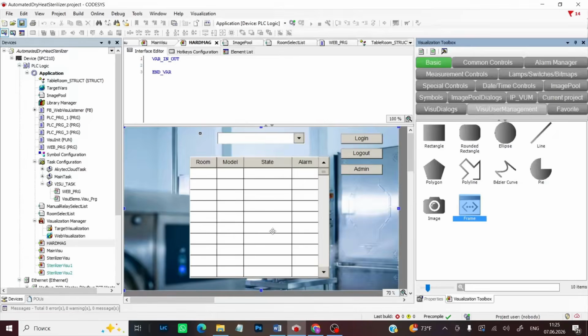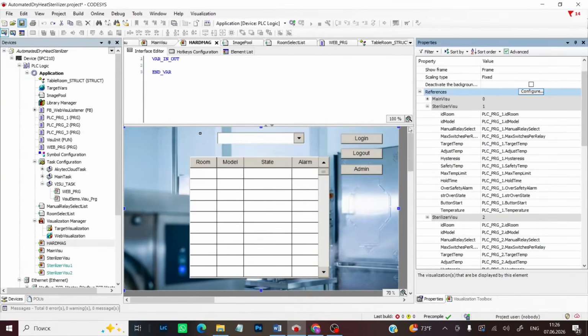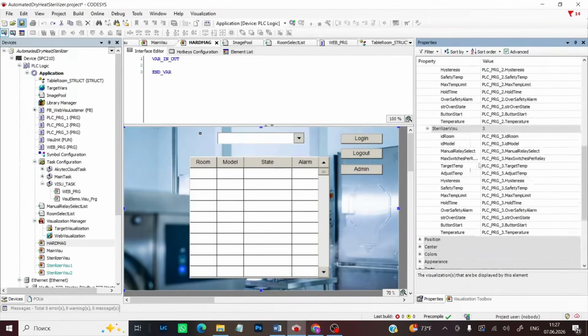Next, I created another visualization file, where I placed a frame component and added 1 instance of the main visualization and 3 instances of the room visualizations where our sterilizers will be installed. In the References section, for each instance of the sterilizer visualization, I linked the variables declared in the Interface Editor tab to the variables corresponding to the specific program.